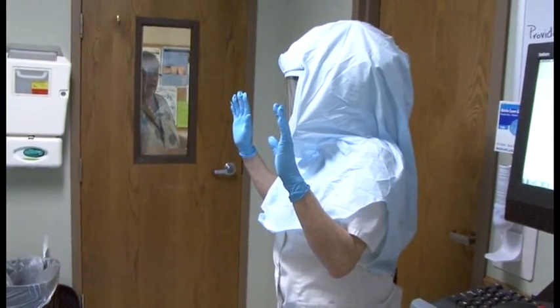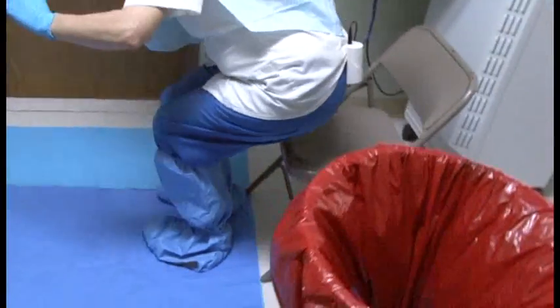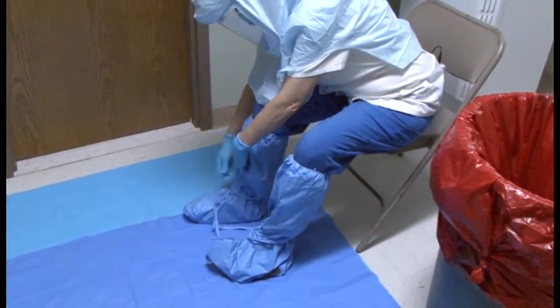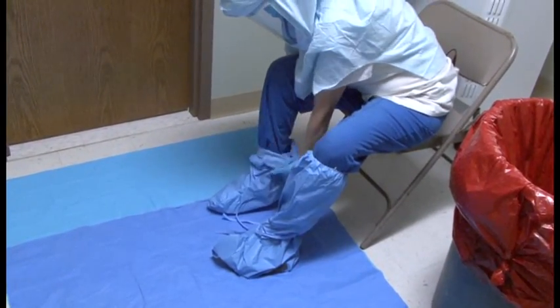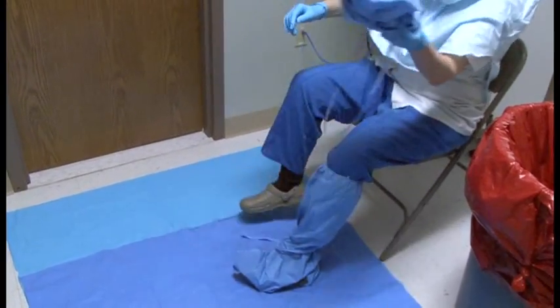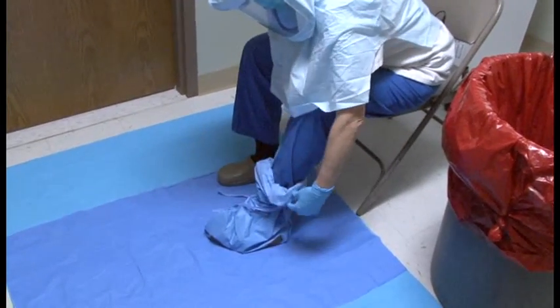Next, Lynn sits in the first chair to remove her disposable boots. It's important to untie the boots and make sure you do not touch your inner pants when removing them. Starting at the top, roll the boots onto themselves downward and slide them off your feet. If your Crocs come off with the boot, they go in the garbage too, but wearing the Croc band behind the heel helps keep them on.